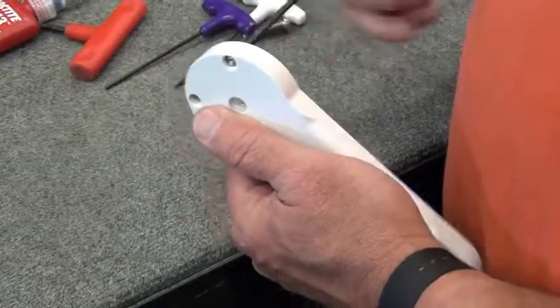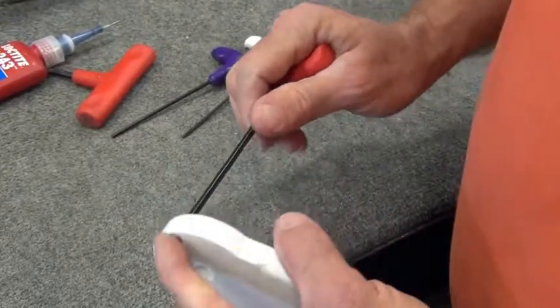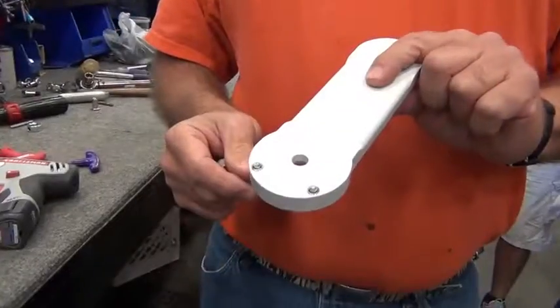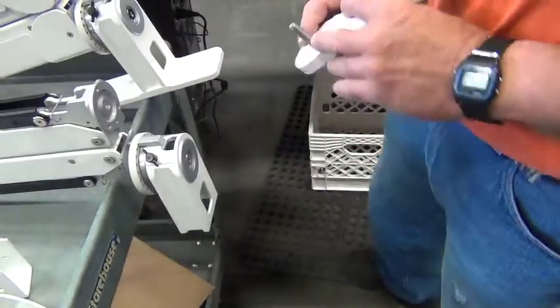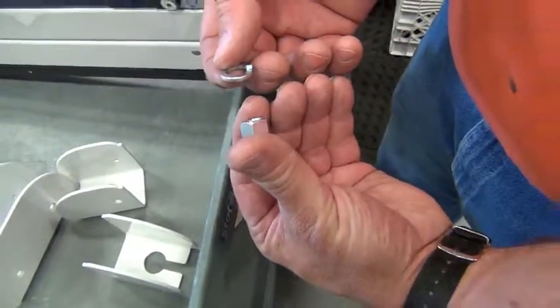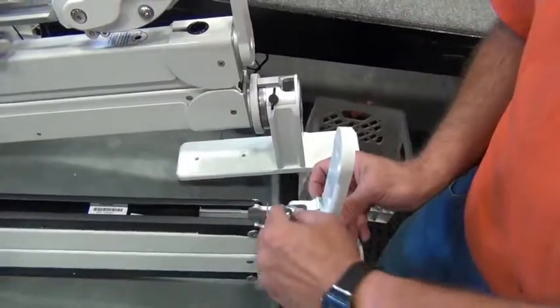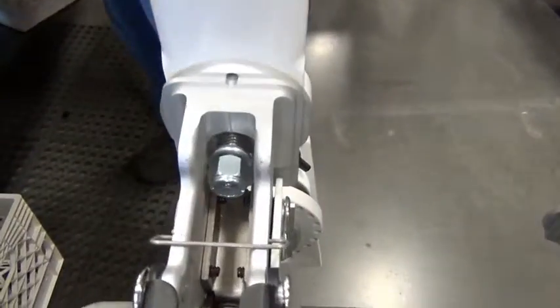A foot is attached to the arm. The foot has two 1/4-20 by 3/8 inch set screws to help keep it in place on the arm. A 3/8-16 by ½ inch bolt is inserted through the foot with a 3/8 inch split washer and large 3/8 nylock nut. The bolt is tightened down on the end frame and torqued to 120 inch-pounds.